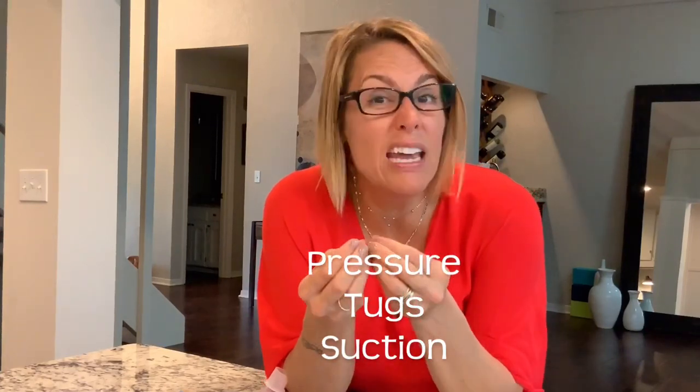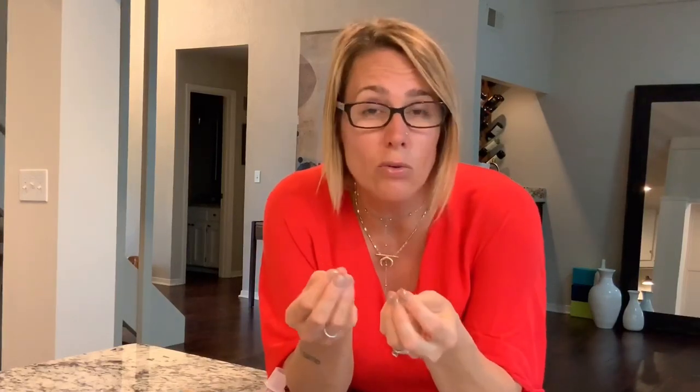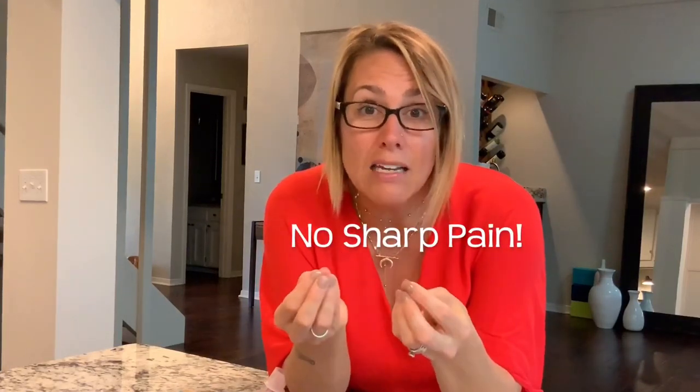What I want to talk to you about is what feels right. It should feel like tugging, pulling, stretching, yanking, pressure. It should never feel like pinching, slicing, or cutting, or anything that's going to make you not be able to talk or breathe normally while you're pumping.